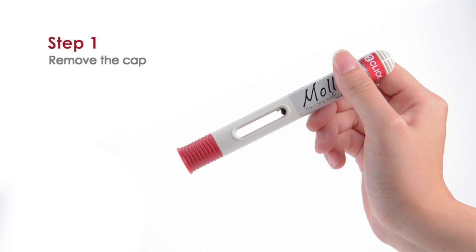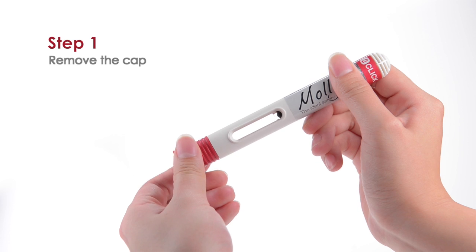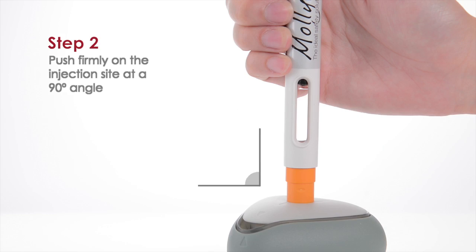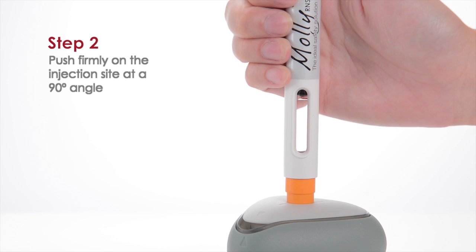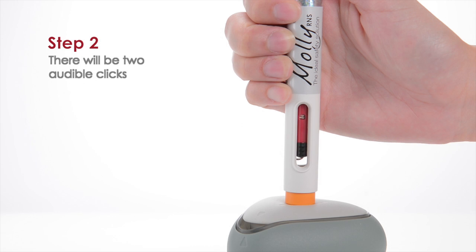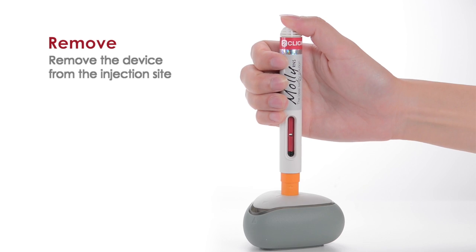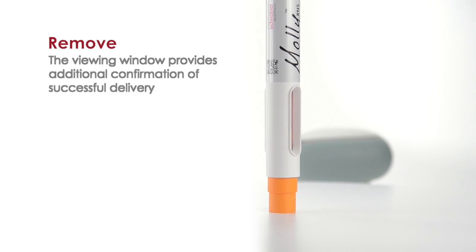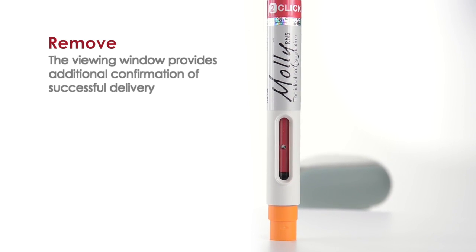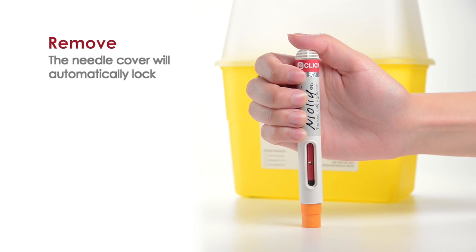To use Molly RNS, first remove the cap, then perform the injection by placing the device at a 90 degree angle. Push firmly against the injection site and hold. There will be two audible clicks — the first signals the start of injection and the second signals the end. Remove the device from the injection site. The viewing window will provide additional confirmation of successful delivery and the needle cover will automatically lock.